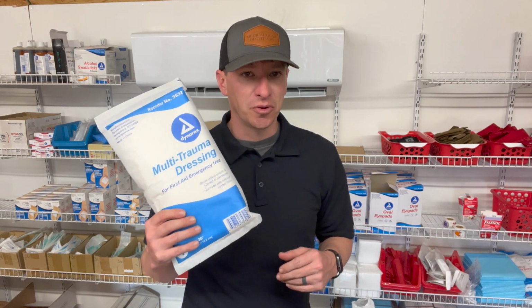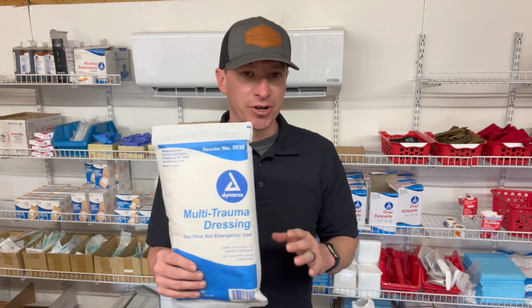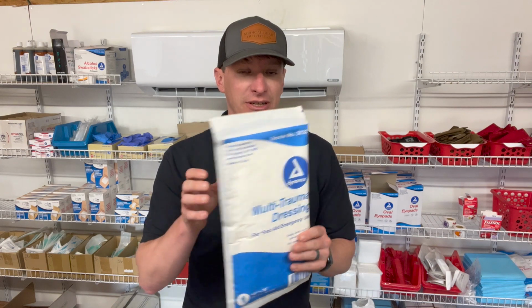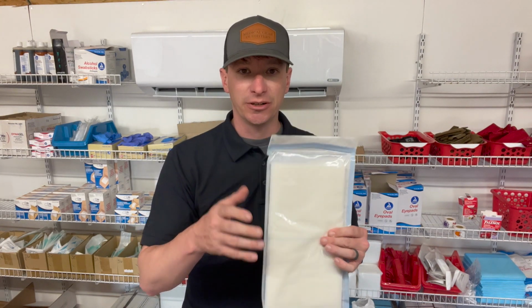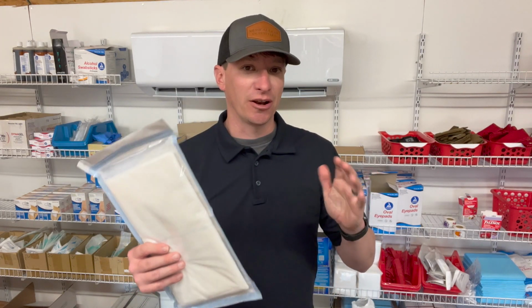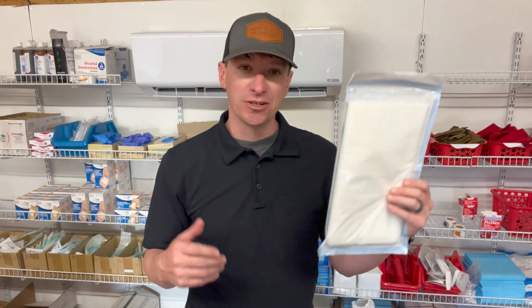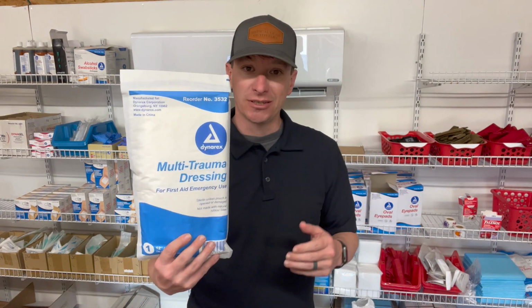This is an item you don't see in a lot of first aid kits, but can be super useful in some emergencies. So this is a multi-trauma dressing, and basically it's a giant 5x9, made of the same kind of material, but a lot bigger bandage. So maybe a vehicle kit, something like that, a home kit. You're not walking around with this in your IFAK on your belt, not gonna work. So I would use this, like I said, in a home kit.